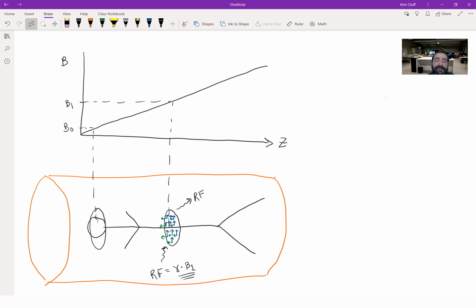Okay, and RF is part of the electromagnetic spectrum that has pretty low energy, or it's safer energy. We've got radio signals all around us. We've got our cell phones, we've got TV signal, whatever, which are usually just RF, okay? And so RF energy is non-ionizing radiation. So MRI, as it turns out, is very, very safe. In fact, we don't know about any negative health consequences due to it at this time.